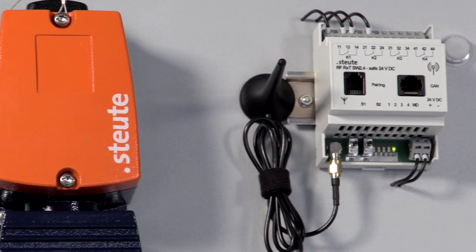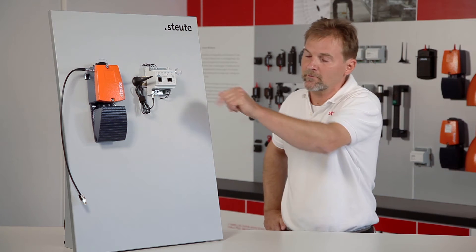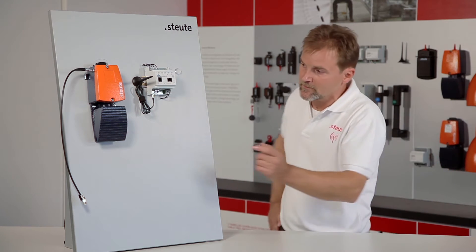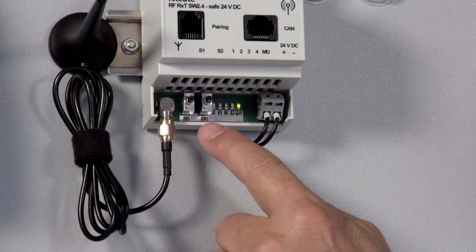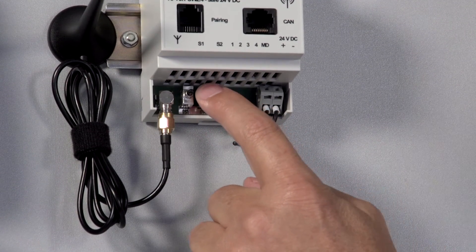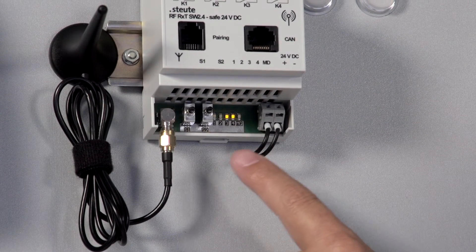Now, to connect the foot control to the receiver, the receiver first has to be set to teach-in mode. We do this by locating the two push buttons S1 and S2 at the bottom of the receiver, pressing S2 and keeping it pressed until we enter the flashing mode via LED combinations and LED 3 and 4 are alternating.